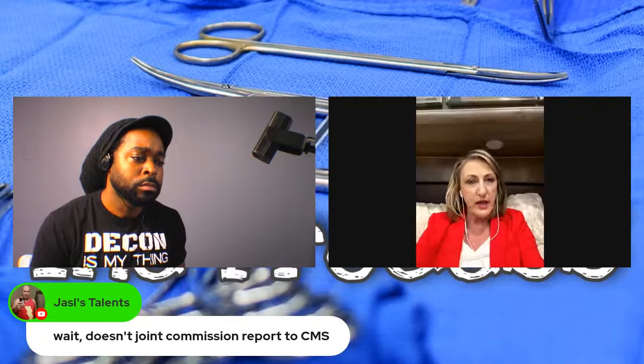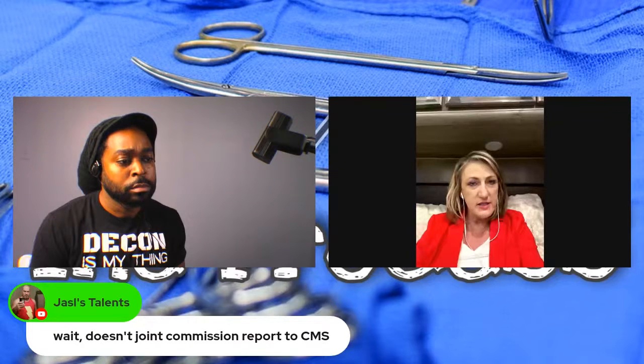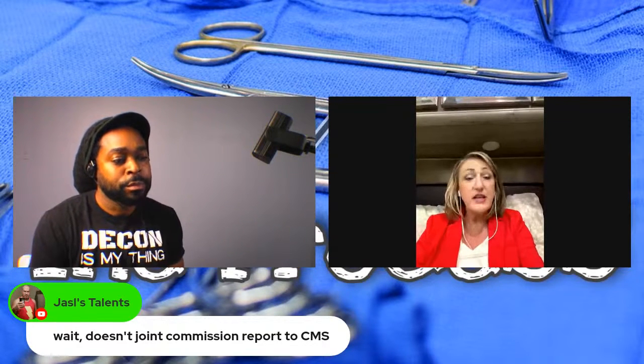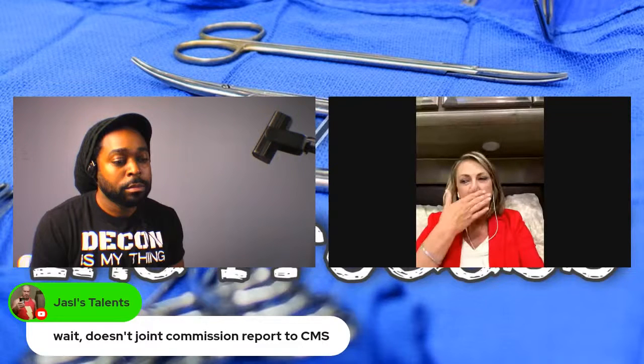Well, they hold it up to the light and look through it with one eye to see if the lumen is clean. Well, this one, actually, we put a scope in and put that through it, and dirty blood came out on the other side. And I'm like, wow. This is what goes into a patient's knee when you don't check the lumens like you're supposed to. And so I'm always surprised.